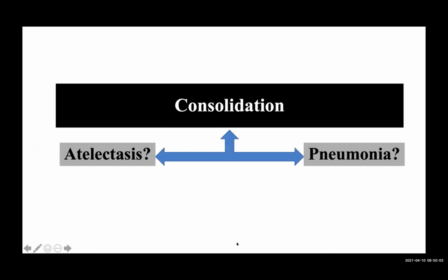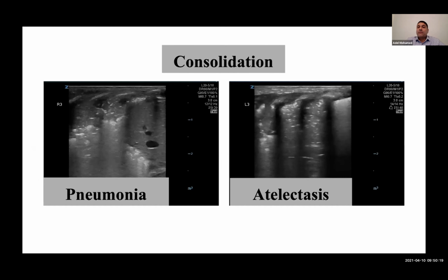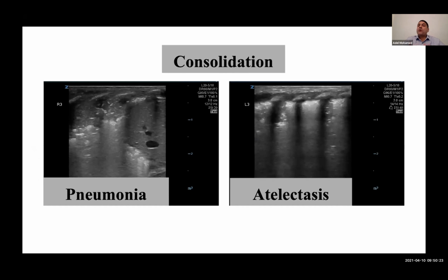Question, consolidation. Another session you will have today is about consolidation. So, a quick glance at the difference between atelectasis and pneumonia. But remember, this is a very conflicting part. Lung ultrasound can help you to say that this is most probably pneumonia, or most probably atelectasis. This case is black and white, like this case that I brought for you here.